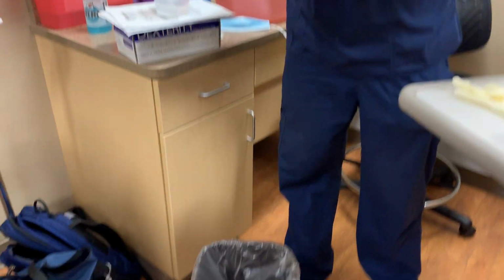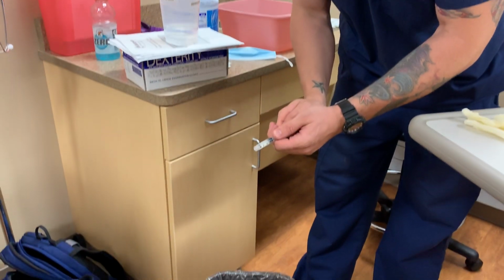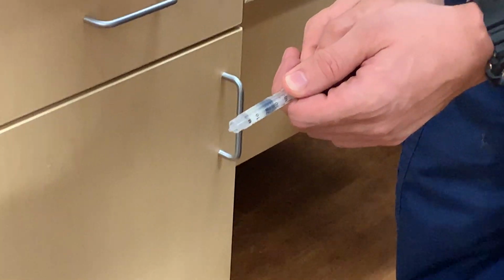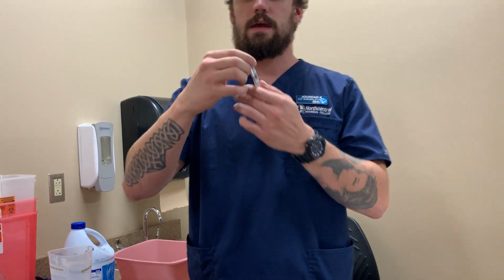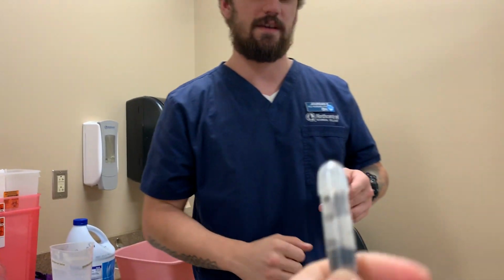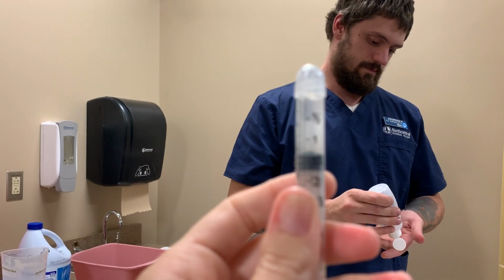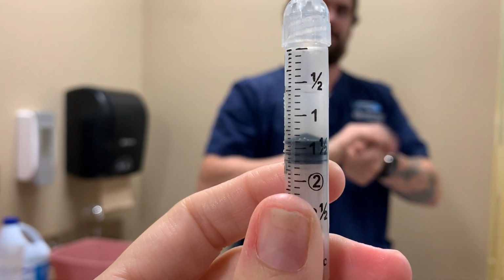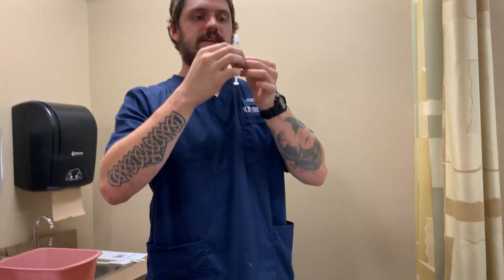And sometimes you have to check your agency policy. Some will do it in a trash can. Others have a black box or something similar to dispense the unused narcotics in. And we will get dose accurate. Okay. And I will allow for my colleague to take a look. Looks correct. Looks correct. The camera got a chance to take a look.